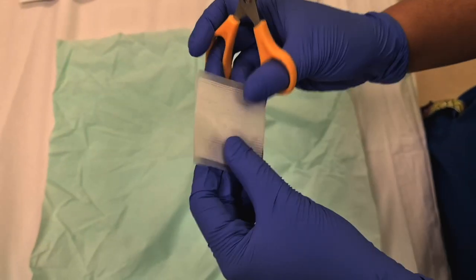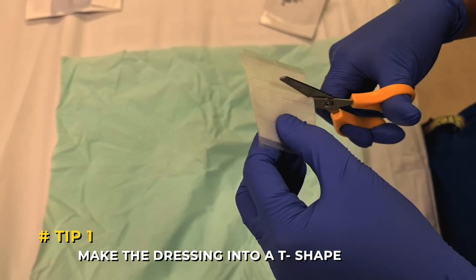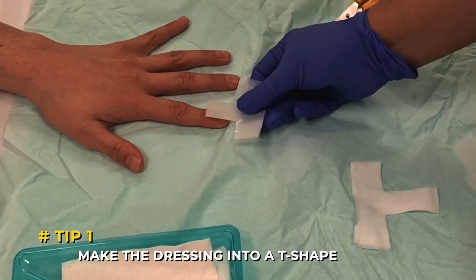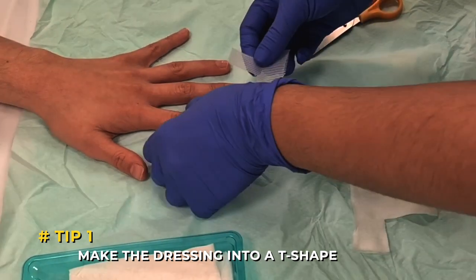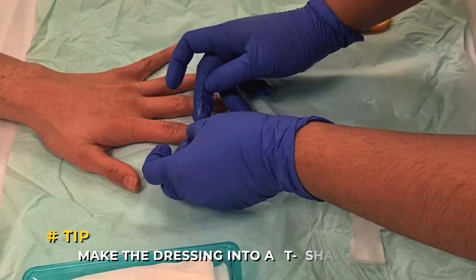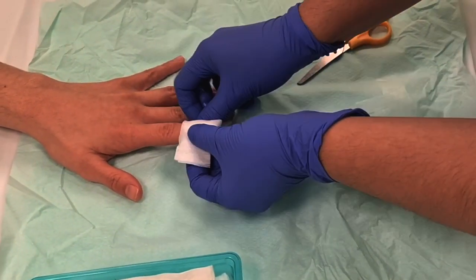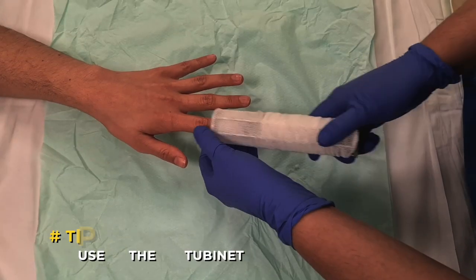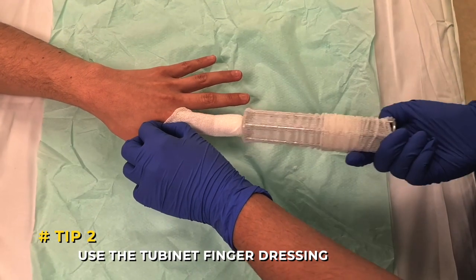Tip 1. First of all, make the dressing into a T-shape. That way it wraps around the tip of the finger tidily like a little parcel. You can do the same with the gauze and then secure that with a little bit of tape if the child's moving.